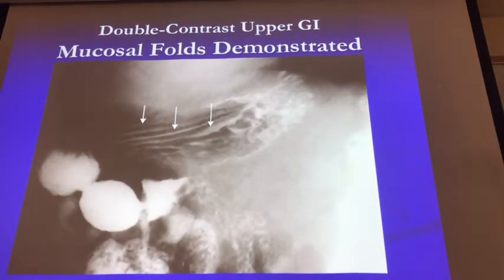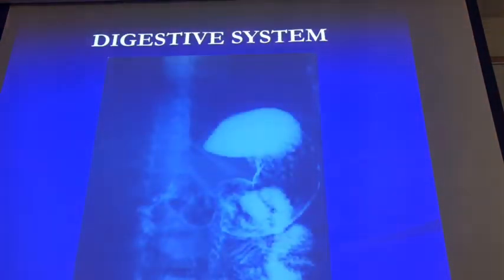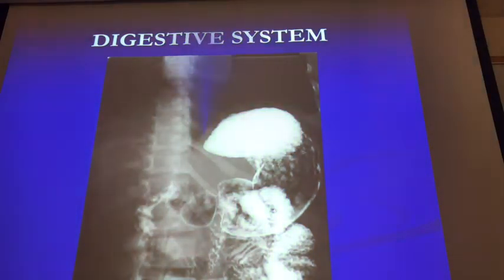Okay? When it's single contrast, you don't see that. So it depends on what they're looking at. Okay? Depends on the pathology. Here, see how nice it looks? Here you go, more examples.